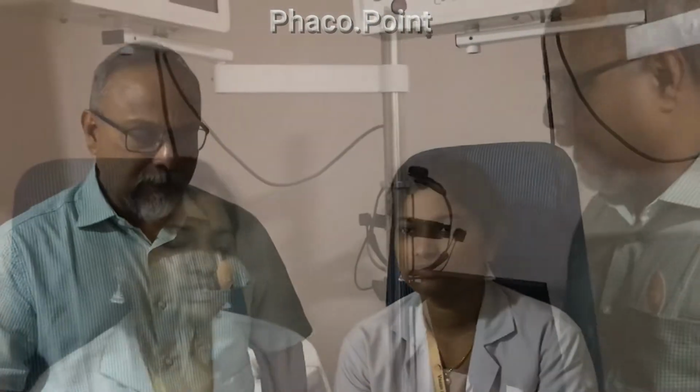So when I shine light on the right pupil, the left pupil is also reacting equally, and this is known as a consensual reflex. Now, having finished the examination on the right side of the patient, you then need to repeat the examination for the left pupil, and for that we have to stand to the left of the patient. So do not try to perform left pupillary exam while standing on the right side of the patient. This is because the patient needs to fixate at a distant target.